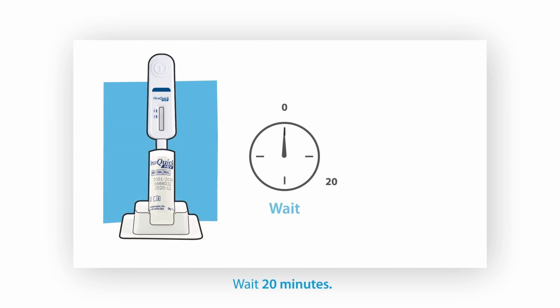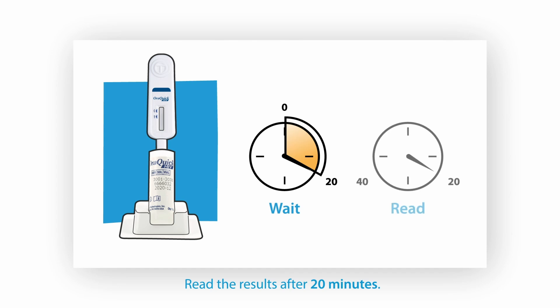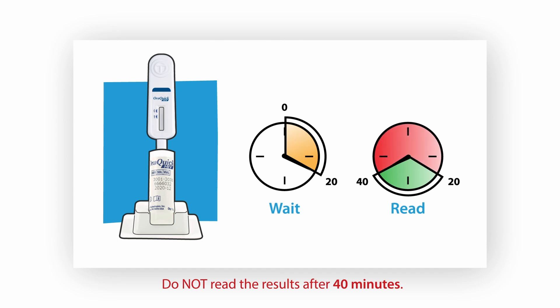Put the flat pad into the tube of the developer solution until it touches the bottom. Wait for 20 minutes. You may read the results after 20 minutes. Do not read the results after 40 minutes.